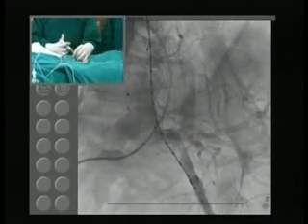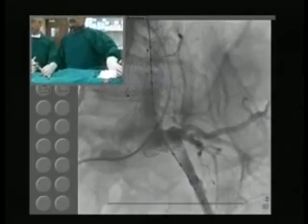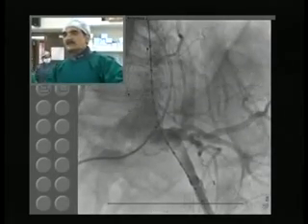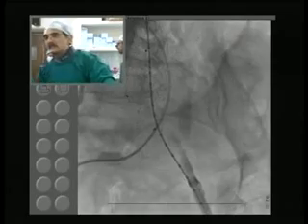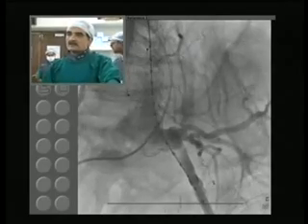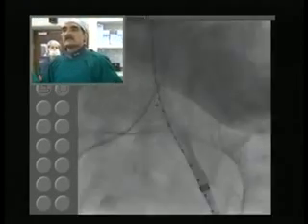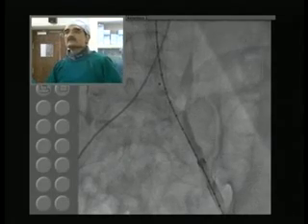Okay, what we can see is that the main device has come into perhaps the beginning of the common iliac, and then we have about 3 centimeters horizontally. So the pigtail is not really aligned coaxial with this. Okay. So we'll change the view to AP view. Let's see if that, maybe we should. Okay. One more picture now.